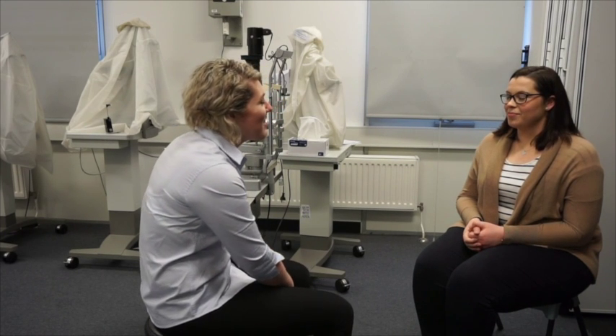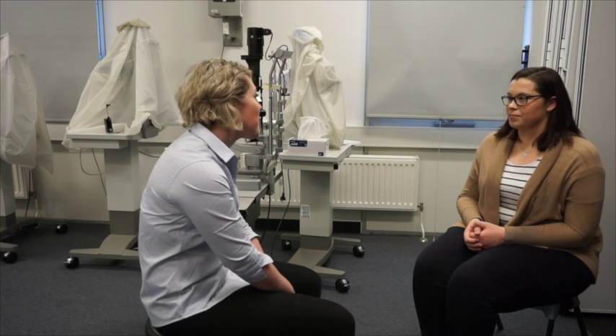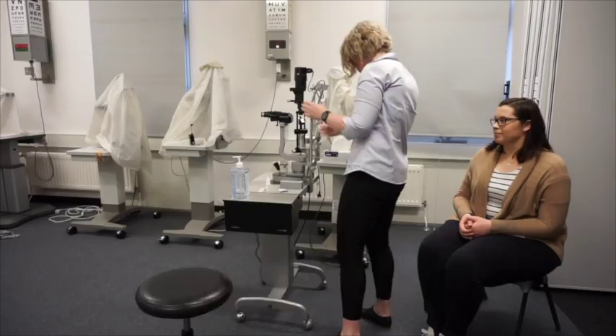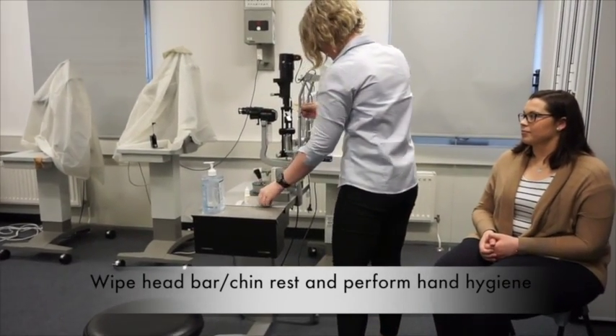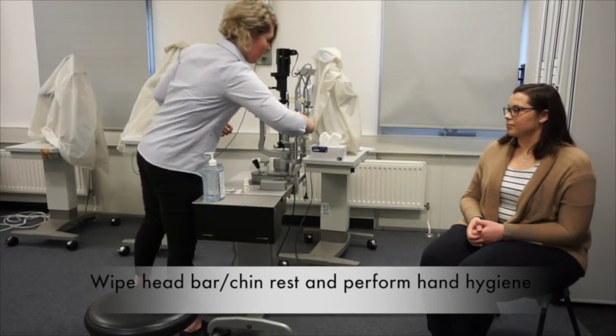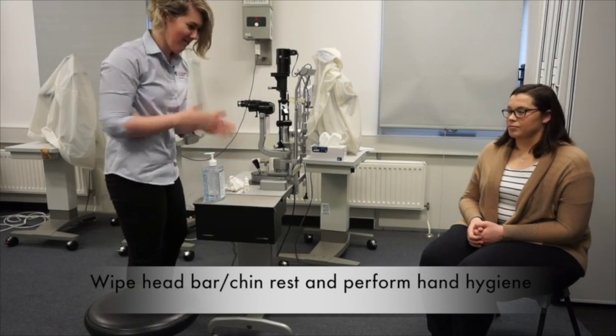Hi Jane, I'm Sarah and I'll be your orthoptist for today. Today we're just going to be measuring your tear film layer and how long it takes for your tear film to break up. Before beginning the assessment, the orthoptist will wipe the head bar and chin rest of the slit lamp with a disinfectant wipe and then will perform hand sanitisation.